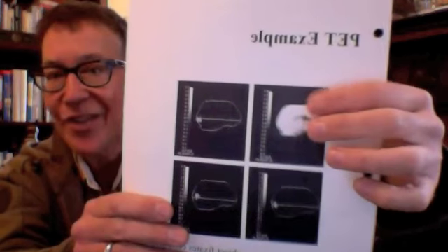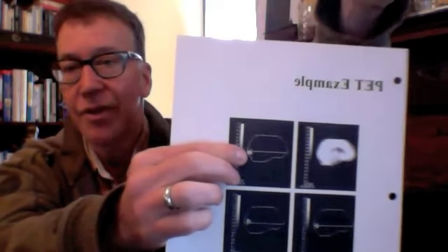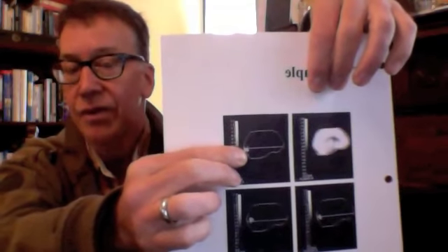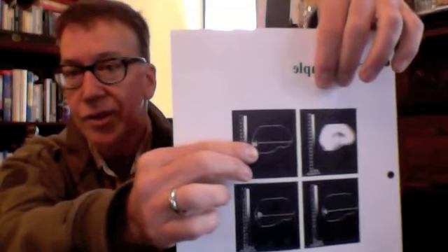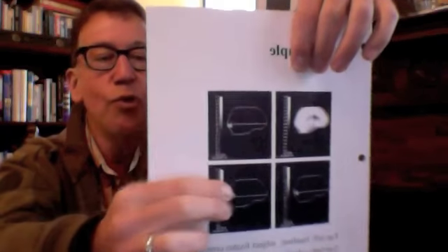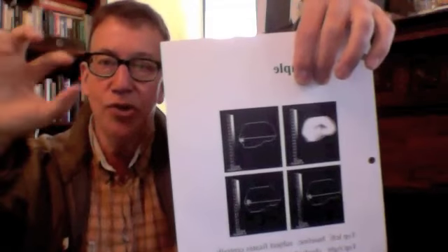And you're going to subtract this signal from your experimental conditions, like when you actually present something visually to the subject. So if you present something at the central fixation cross, they presented a checkerboard, right? So kind of a visually arresting stimulus at the fixation point. You see, when you subtract out the general blood flow under the control condition, heightened blood flow, right? This is more decay of radioactively, let's say it is oxygen that was injected into the blood, O15, at this location, right? And then as you move the checkerboard, you actually move the blood flow changes around the brain.